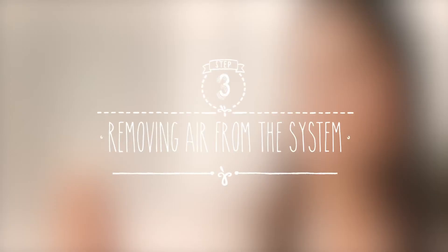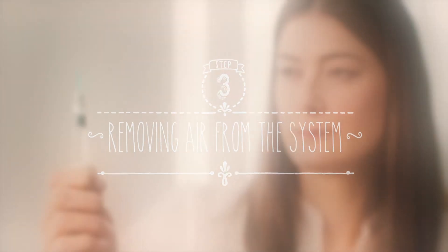Hold your pen with the needle pointing upwards and pull off the outer needle cap. Keep it handy, as you'll need it later. Before using your pen, you'll need to make sure there's no trapped air. Look carefully at the reservoir holder. If you don't notice a large air bubble, the pre-filled pen is ready for use. An air bubble is large if it fills the tip of the reservoir holder when holding the pen with the needle pointing upwards. There may be some small air bubbles that stick to the inner wall of the reservoir — do not be concerned about them, they do not need to be removed.